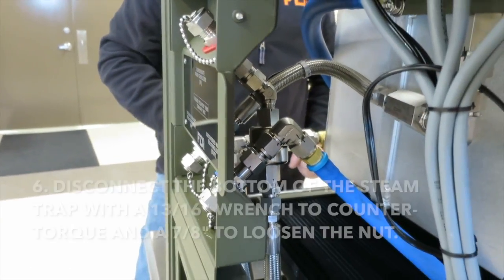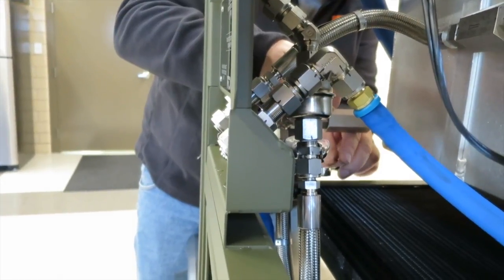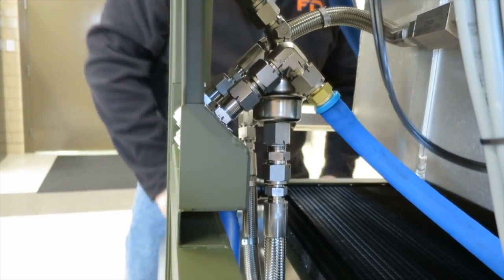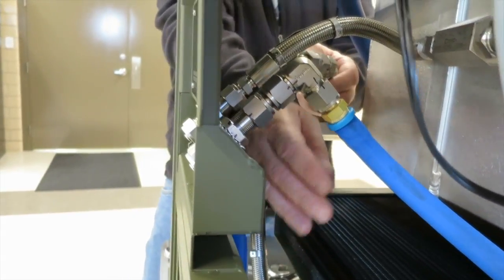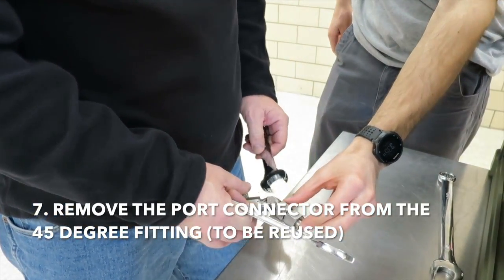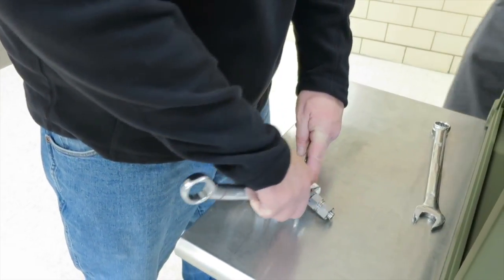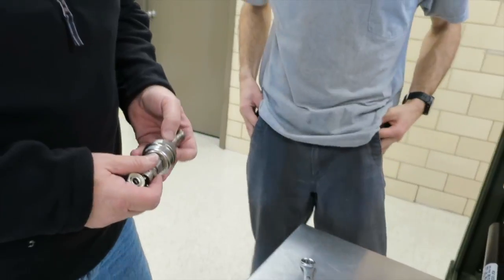Alright, now step 6, he's going to disconnect the bottom nut of the steam trap. This time he's going to use a 13/16 wrench to counter torque, and he's again going to use a 7/8 inch wrench to loosen the nut on the hose connection. Now the next step is to remove the port connector off of the 45, because we're going to reuse this port connector on the replacement part. Alright, and so that's it for removing, and we'll show you how to replace it here in a second.